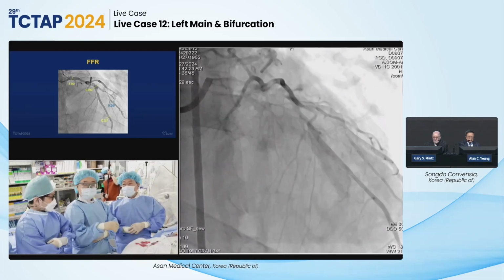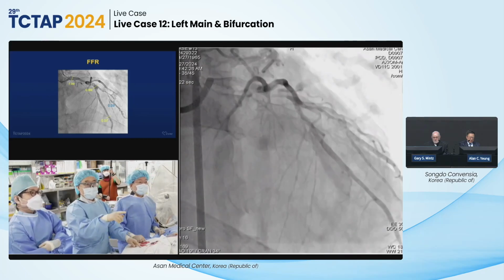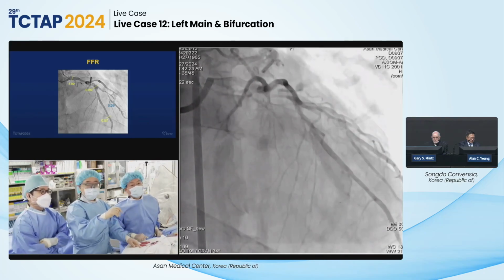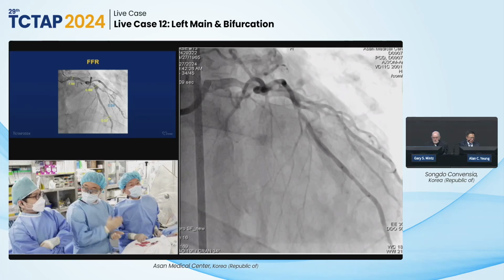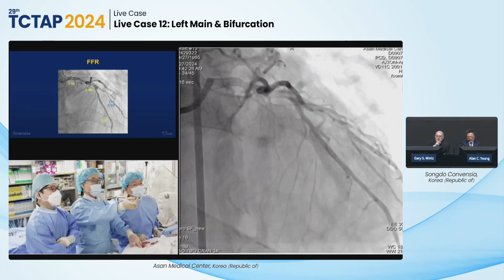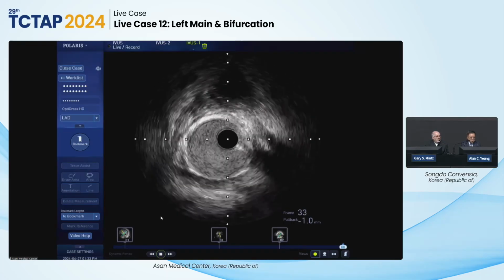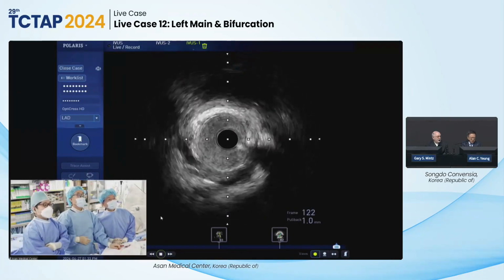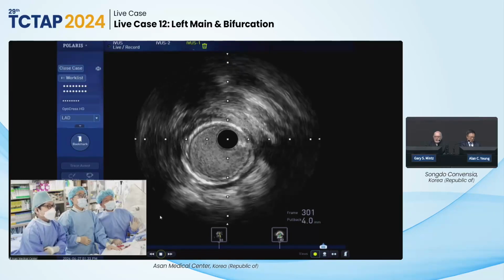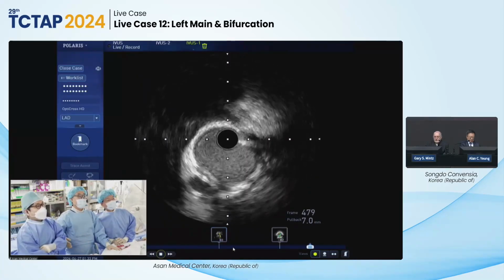This patient was in the randomization phase of the main trial, randomized to FFR-guided, and FFR showed a significant reduction of flow, so the decision was PCI. The decision was already made. We checked IVUS, and we're going to show it. Before you do that, I have one other question. There's this fistula coming off the distal left main or proximal LAD. How does that affect it? This is a gorgeous muscle bridge, the myocardial bridging part. This is as good as it gets.